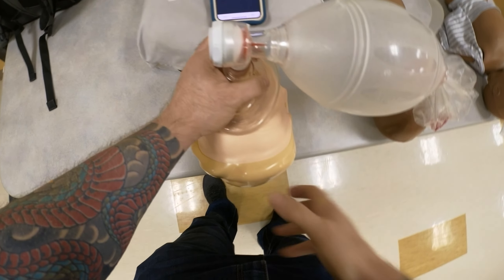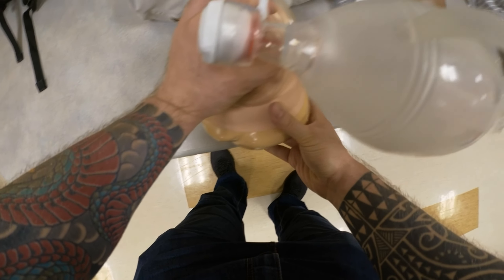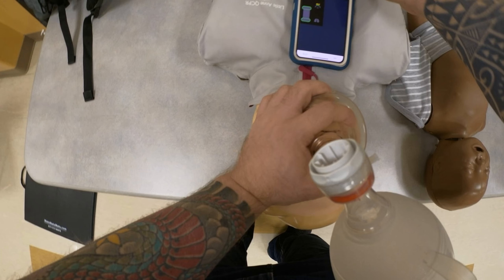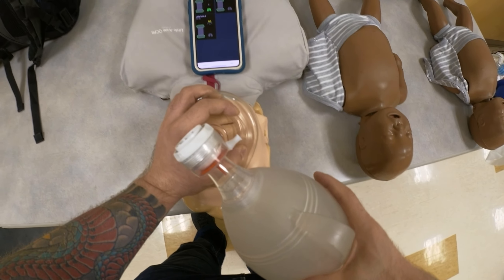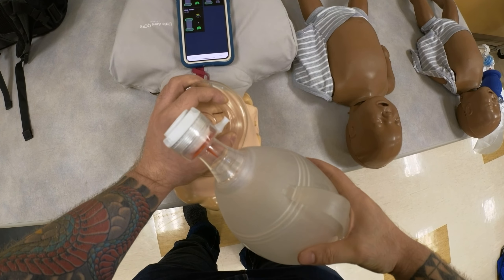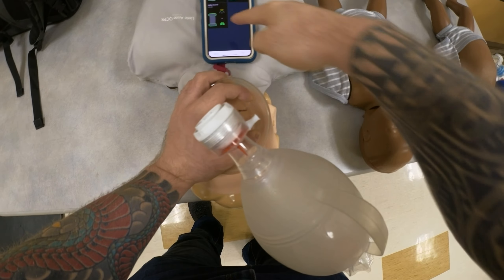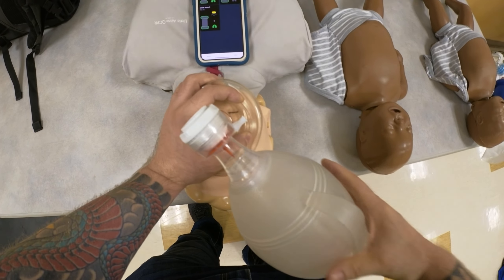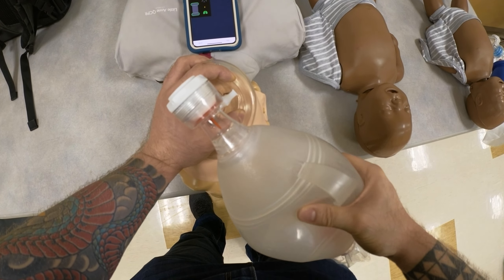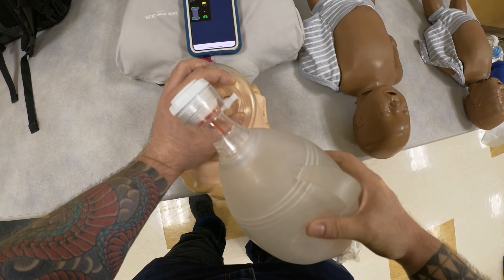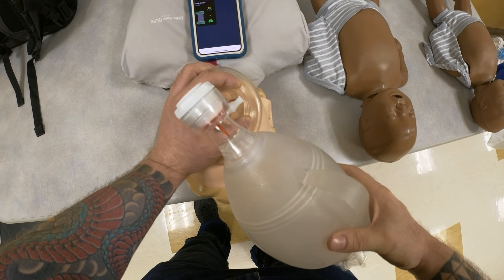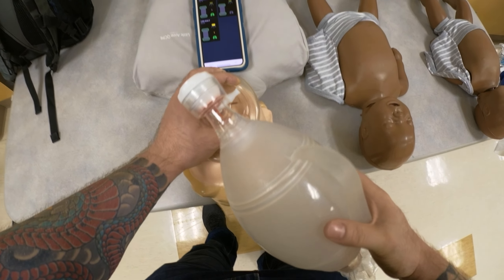This mannequin, same as the little baby, will also show ventilation. If I attach a BVM right now — you can see my breaths were delivered, and at the bottom under Little Annie, my breaths are going through.